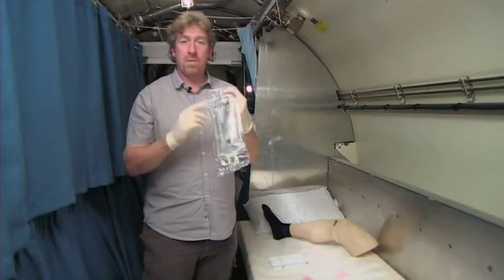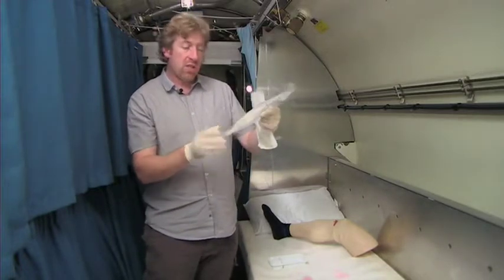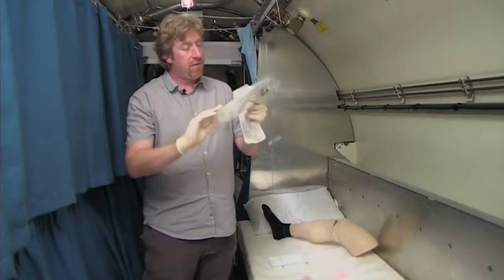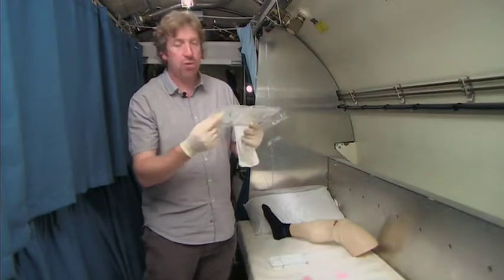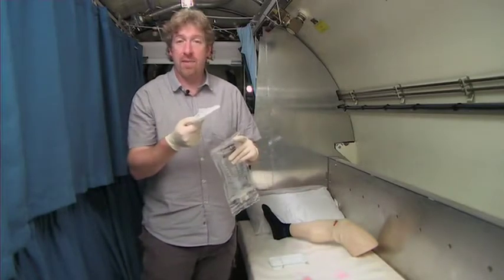You have your fluid that has been prescribed by the topside doctor. Make sure that it's within date. Have a look at the back of the fluid just to make sure there's no crystallisation there. Also check your giving set — make sure it's within expiry date.